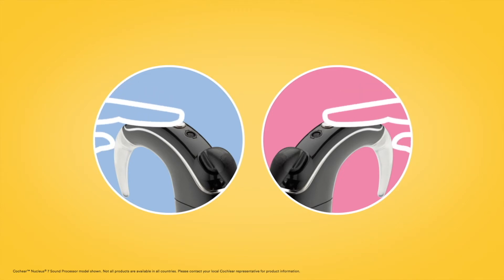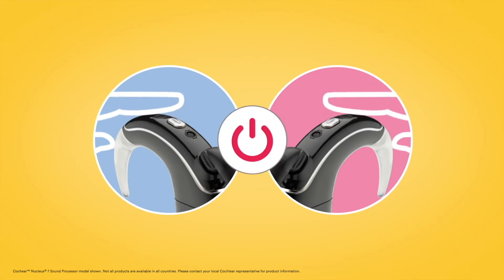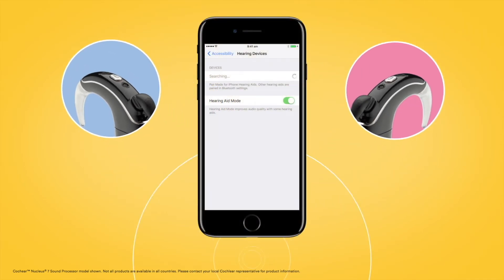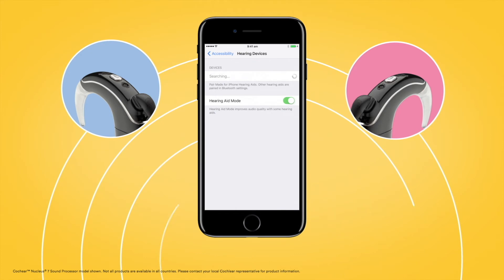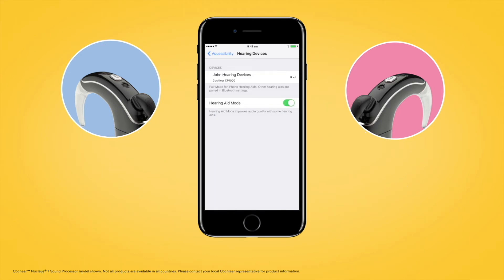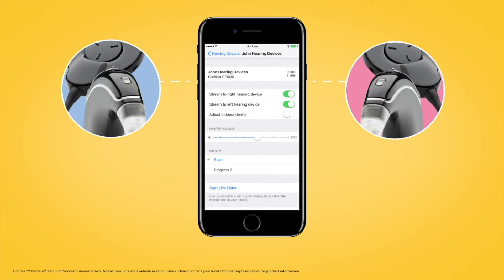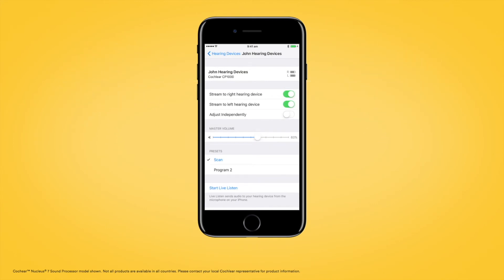To do this, turn each of your sound processors off and back on again. Your compatible Apple device will search for your sound processors and display them as a pair in the Devices section. Select the name of your processor and then tap Pair for each side to begin pairing both your Nucleus 7 sound processors with your compatible Apple device. Make sure to confirm pairing is finished as previously described for each processor.